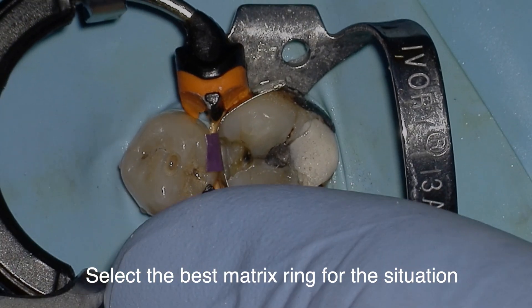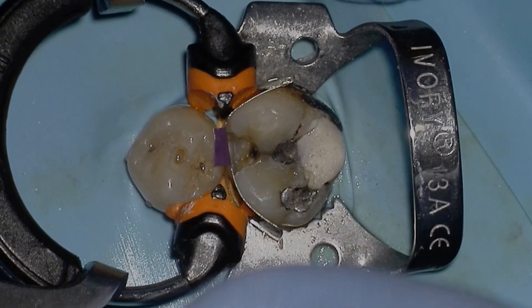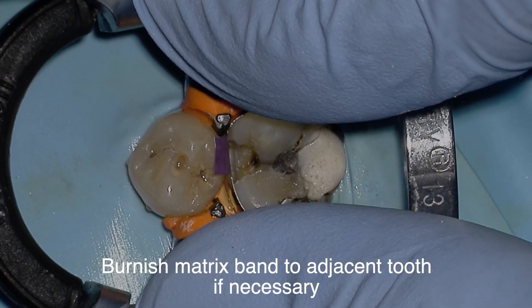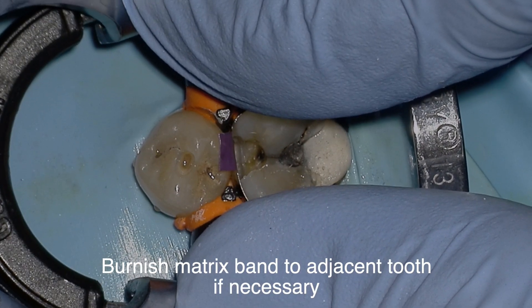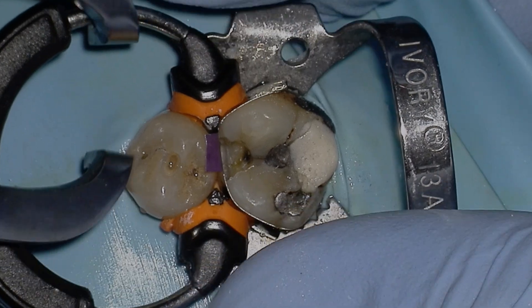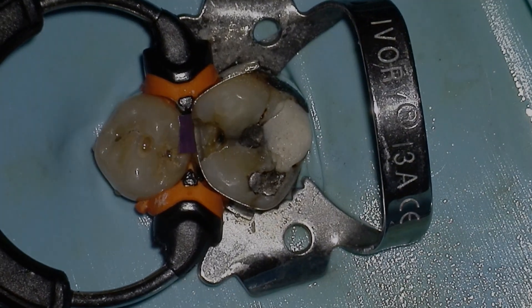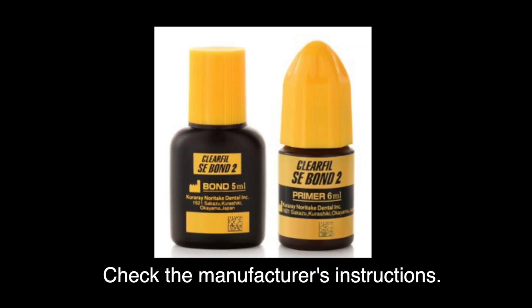Tip number ten: use a sectional matrix ring. There are totally different types and sizes, and they are the icing on the cake for making a perfectly contoured restoration. You may also want to burnish the matrix band to the adjacent tooth — I don't do it in this video, but it helps ensure you have a perfect contact.